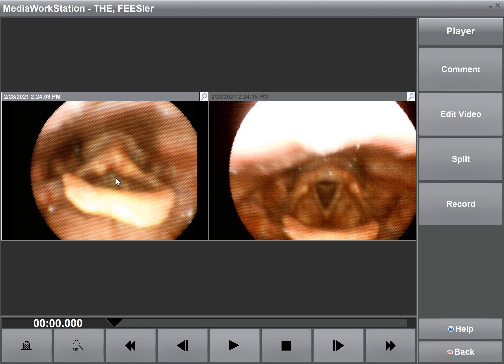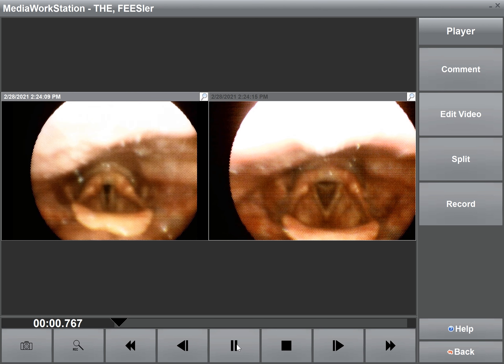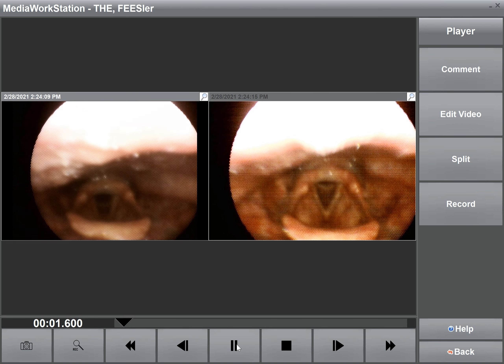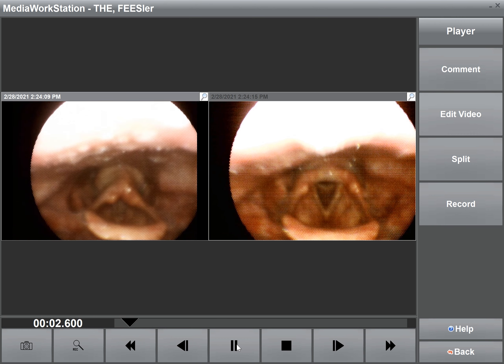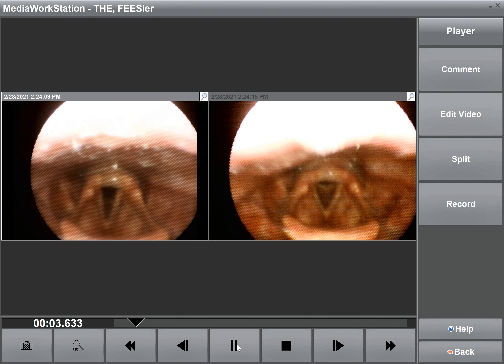Remember, automatic exposure can be very useful as you are avoiding over-exposure when you look at anatomical structures. Now let's look at three consecutive swallows.